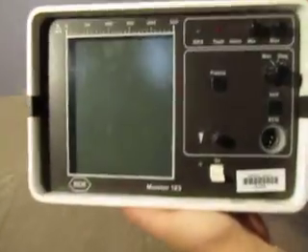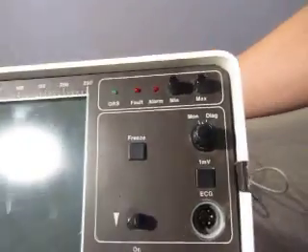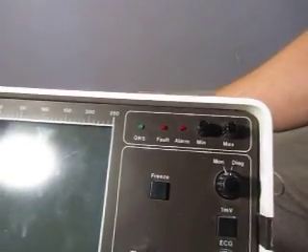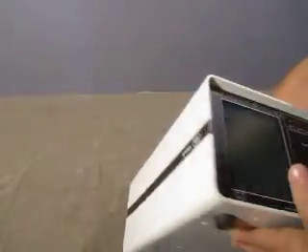Bringing up the camera — a few fingerprints there. On/off, freeze — I'm not sure what all this stuff does. We'll turn it on in a second. It's got a few scuffs.